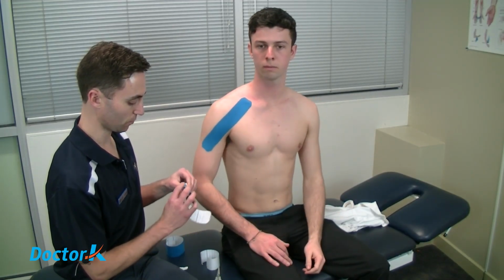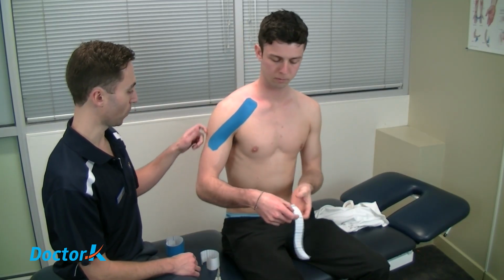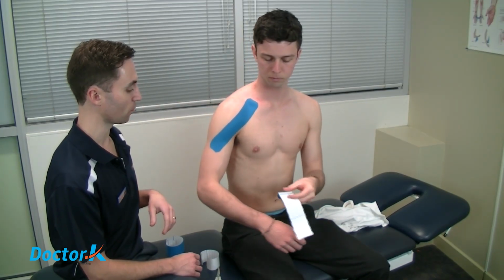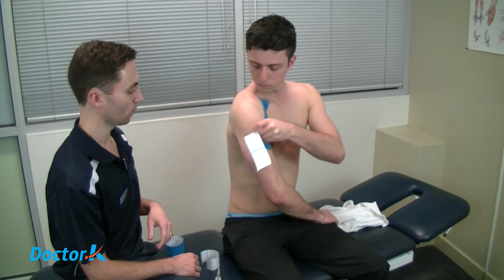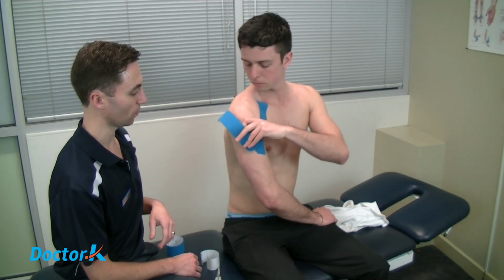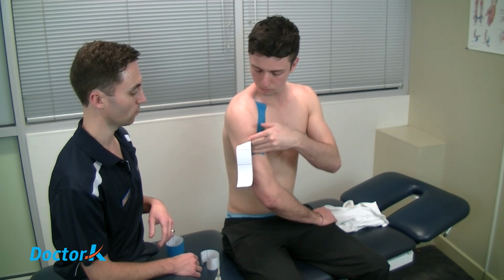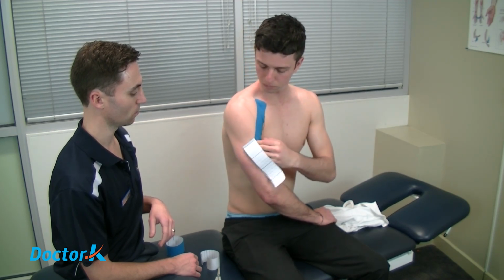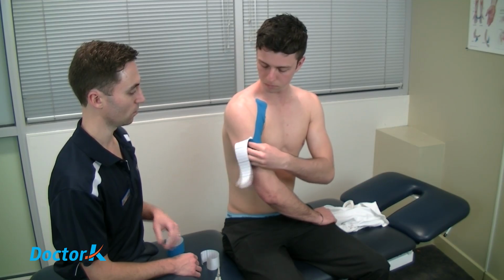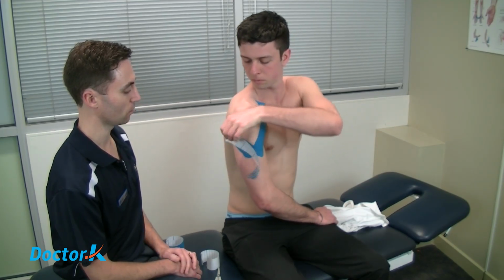And our second piece, give it a good rub, that's right. We're going to do our little fold and tear. Simon can take over from here. And we're going to go around the back this time. So we're going to reach across our body with the arm, placing our piece at the base of that deltoid opposite where the other piece is. Good job, and peel back the length of the tape.